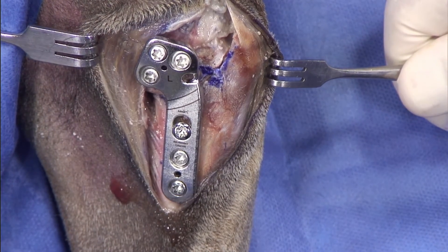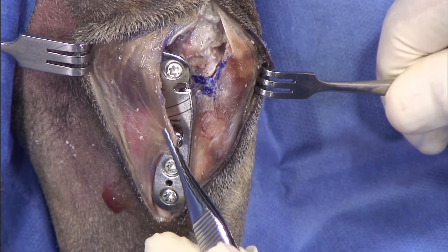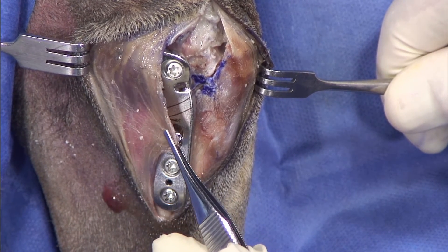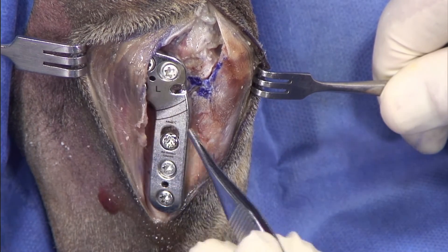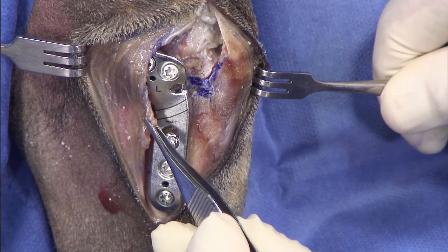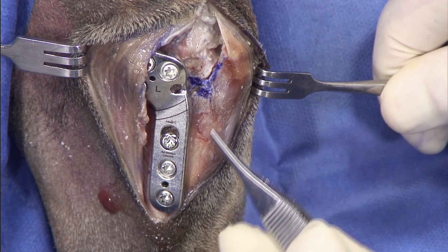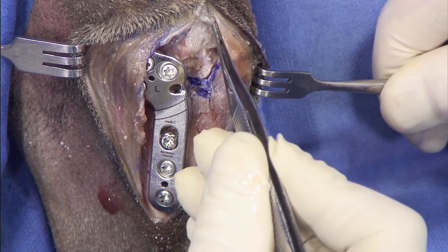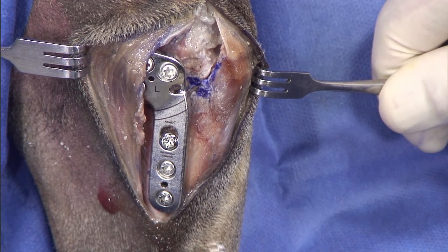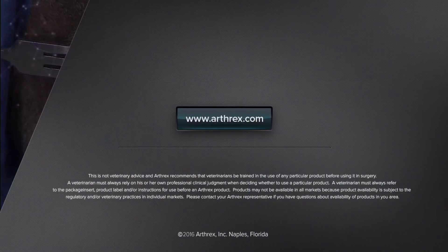Regarding the closure, I want to be sure that we cover the plate very meticulously and carefully. You can see that we have nice fascia that we dissected right here. I'm going to close the fascia on the edge of the fascia, cranially. I start my closure right where I did my exposure behind the patella and progress all the way here.